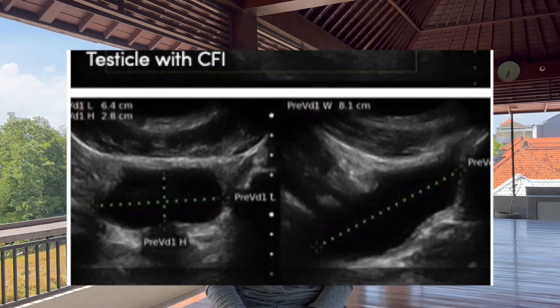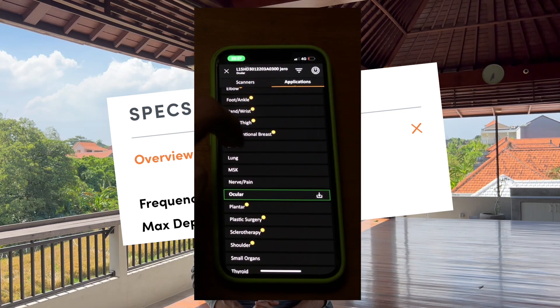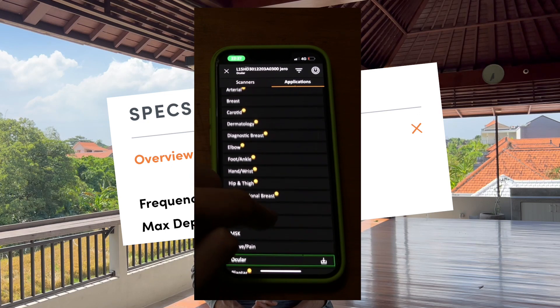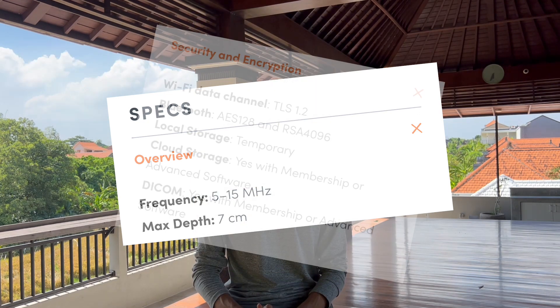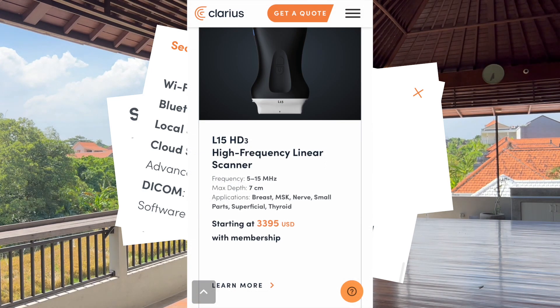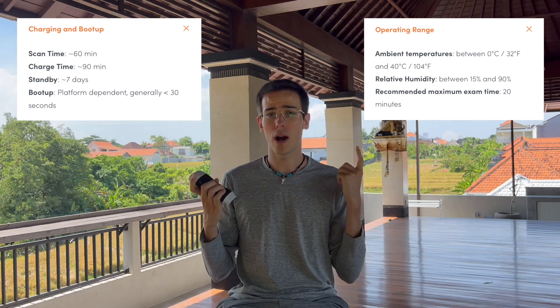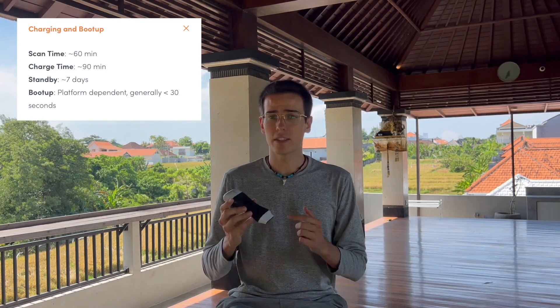The ultrasound frequency ranges from 5 to 15 MHz with a max depth of 7 cm. The L15 standard clinical presets are Musculoskeletal, Lung, Nerve, Pain, Ocular, Small Organs, Thyroid, and Vascular. It has HIPAA-compliant cloud storage and DICOM, unlimited users, and different packages available for different specialties — I'll discuss further when talking about the price. The battery lasts up to one hour, though not non-stop, and depends on conditions; for example, heat reduces scanning time. It can be charged to about 50% in half an hour.